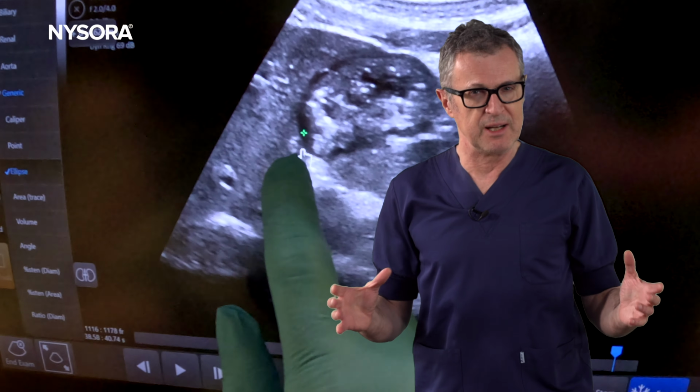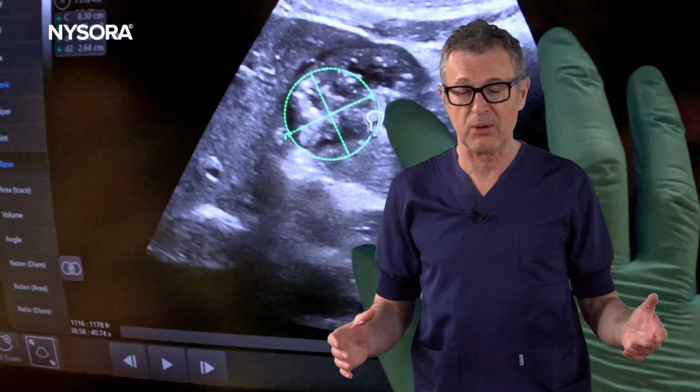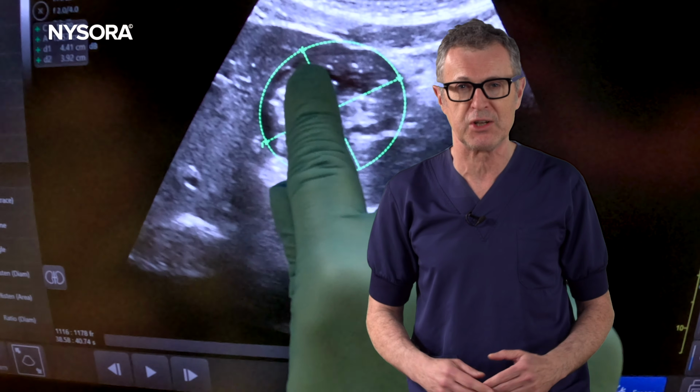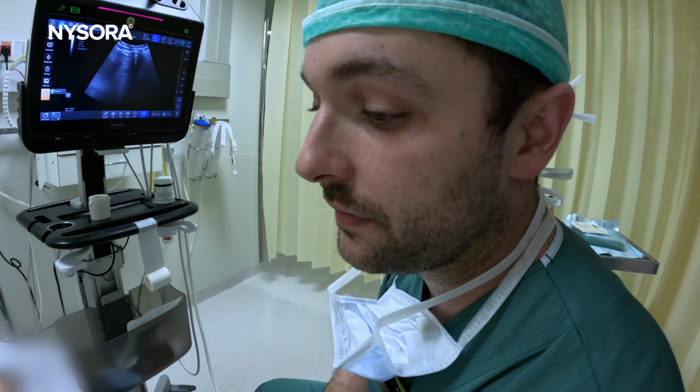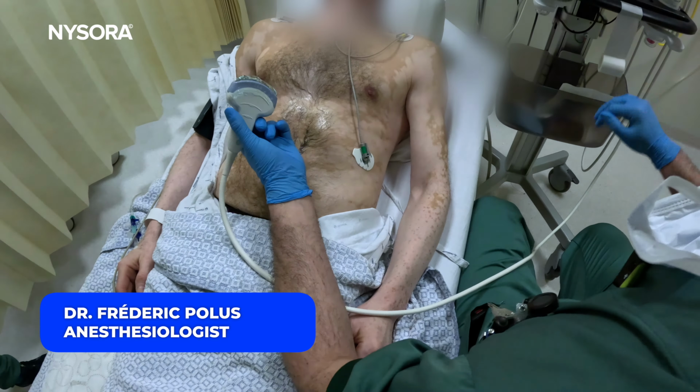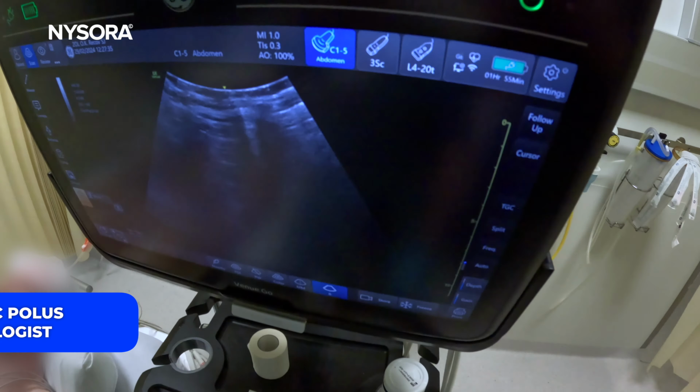Gastric ultrasound can help identify the presence of solid or liquid contents in the stomach, guiding the choice of the safest anesthesia induction technique. In this video, Dr. Frederick Paulus, the NYSORA's fellow, will demonstrate the use of gastric ultrasound in an actual patient with a history of delayed gastric emptying.